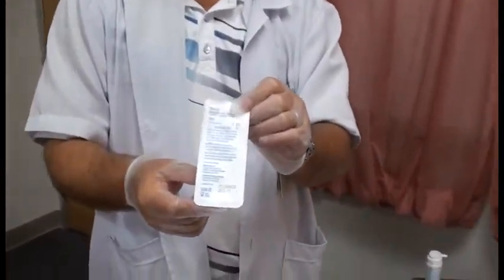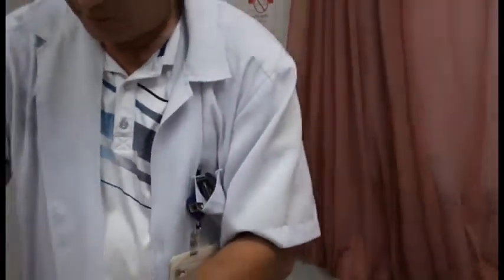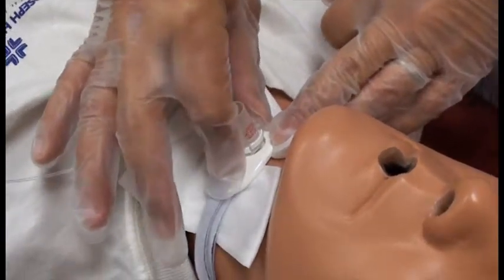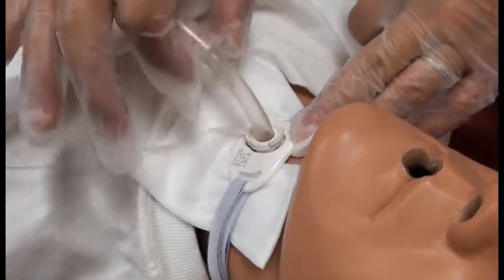So after we replace the tracheostomy sponge, we can now replace the inner cannula. And as I said earlier, these are all disposable, so it's a one-time use. And the inner cannula is sterile, so we need to keep a sterile field as far as when we're replacing that. And we have here our disposable inner cannula. And we just open that. And we're going to slowly remove the inner cannula from the trach, and it's clipped on there, so you just push on this and then pull it out slowly.